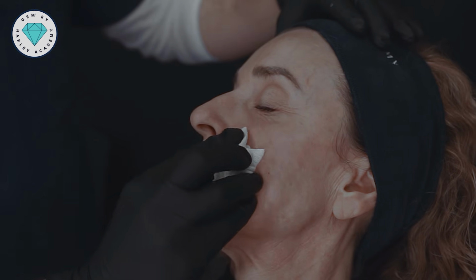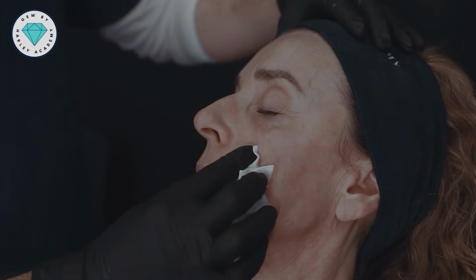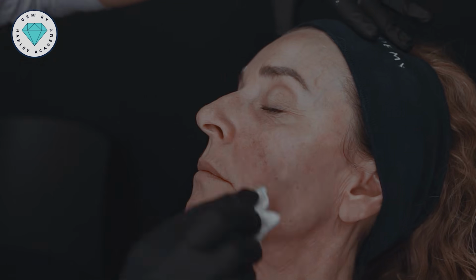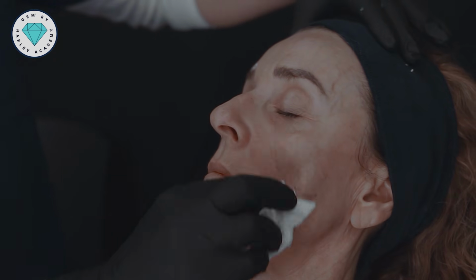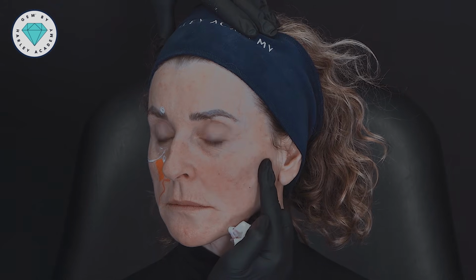After injection, we can just gently mold that. But for me now, this has really improved that hollowing in the medial cheek. So let's have a look. Do it forwards. Forwards. So I hope you can appreciate here an improvement.